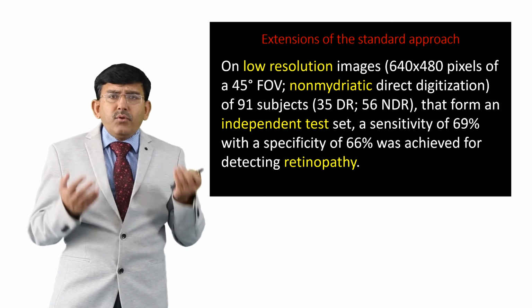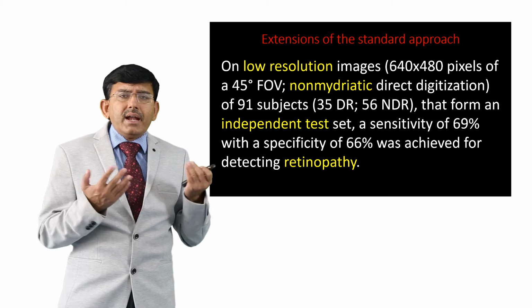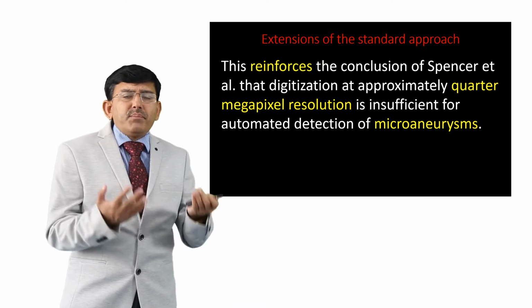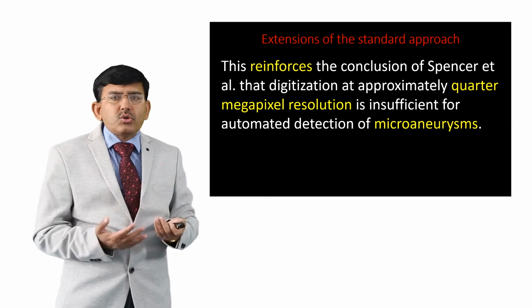This reinforces the conclusion of Spencer and his group that digitization at approximately quarter megapixel resolution is insufficient for automated detection of microaneurysm.